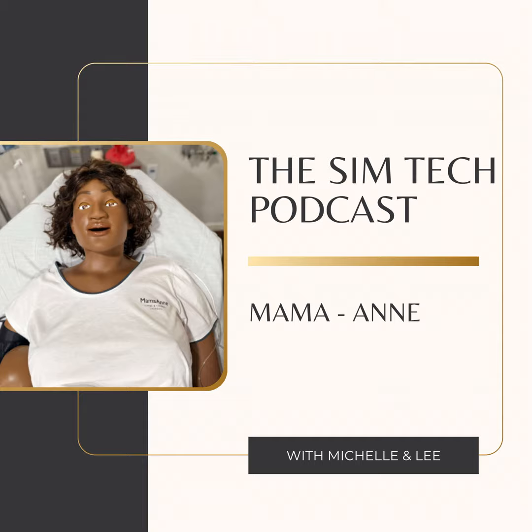You should be able to see in the bottom right hand corner of the screen everything that I'm doing as I'm going along. And for those of you that are just listening and not watching the live demo, hopefully you can catch up on it later on. So for this, I'm just going to select that I've got a healthy patient, so I've got a healthy mum that's just about to give birth. And then it brings you up a screen to say what type of delivery you are going to be doing.